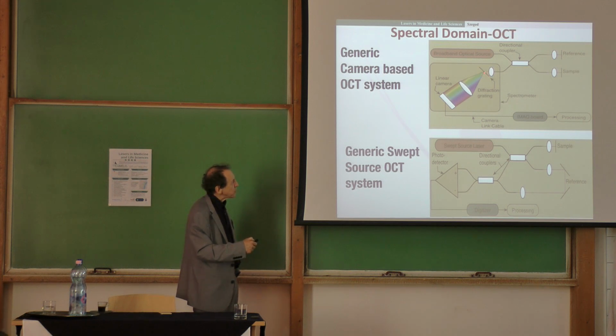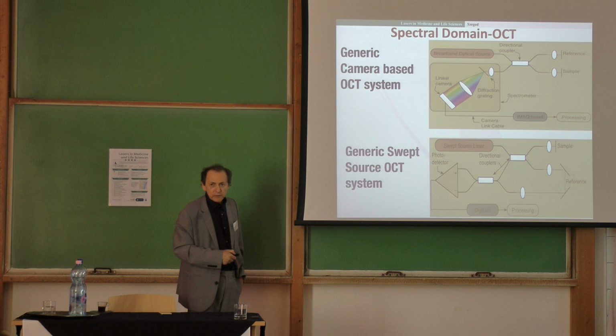The diffraction grating will diffract different wavelengths at different angles. And with a lens, you collect different colors on the camera here. So on these pixels you have the red, on these pixels you have the blue. So practically here we display the spectrum at the interferometer output. You may say, what is the spectrum here? In fact, this one is exactly this one. Why?